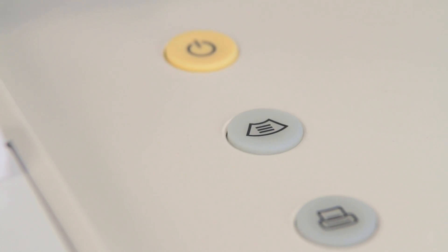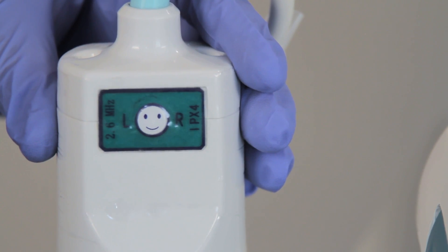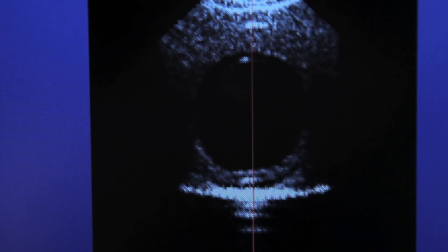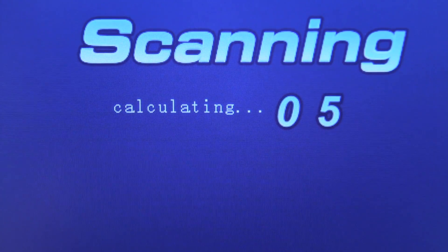press the scan key on the control panel or the smiling face button on the probe to scan the bladder. Do not disturb the device during scanning. The scan time could take up to 10 seconds for a 12-image scan and up to 20 seconds for 24 images.